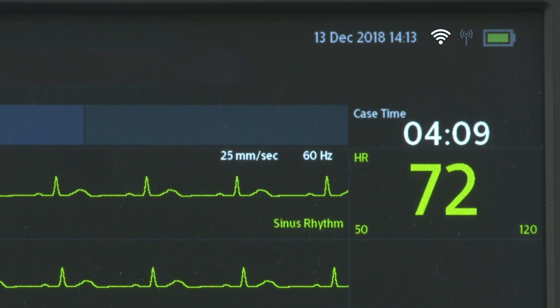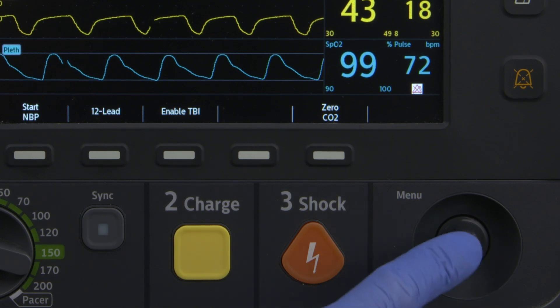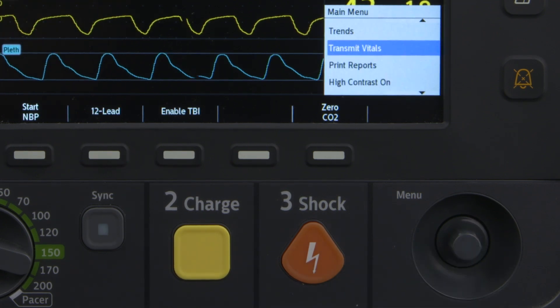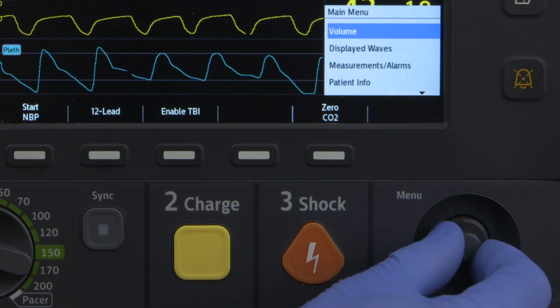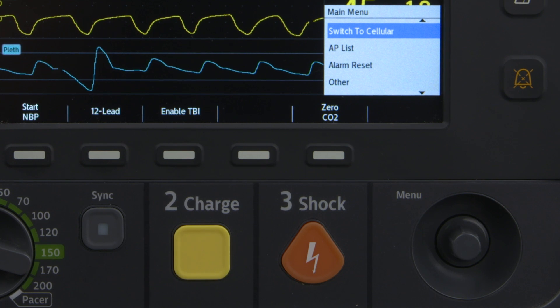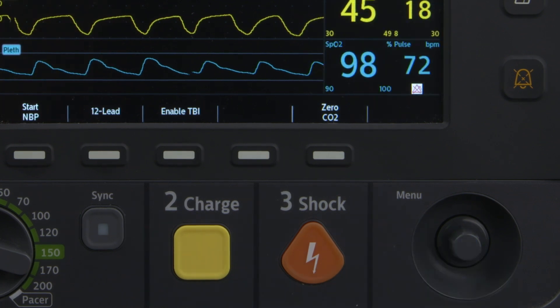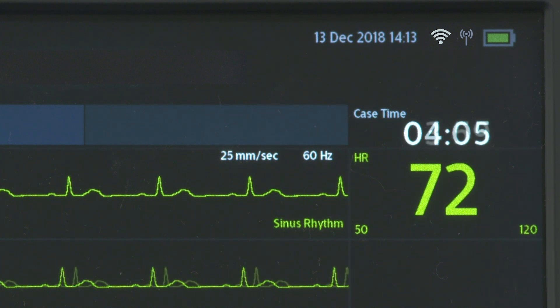The HeartStart Intrepid defaults to Wi-Fi transmission. To switch to cellular transmission, press the Smart Select knob to bring up the main menu, then select Switch to Cellular. The Wi-Fi icon indicates an active Wi-Fi network connection, while the cellular icon indicates that cellular or mobile transmission is available.